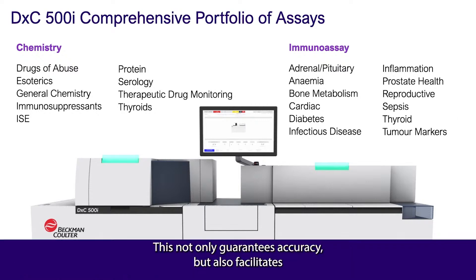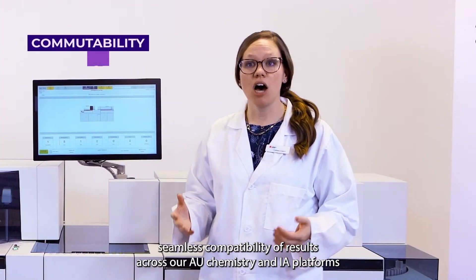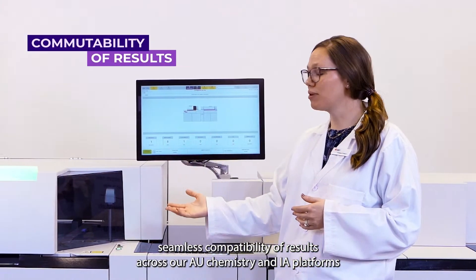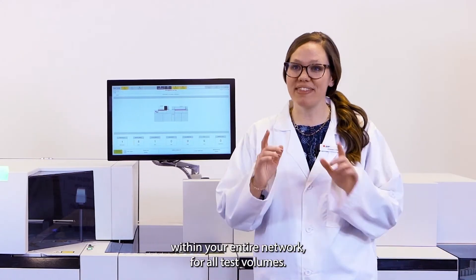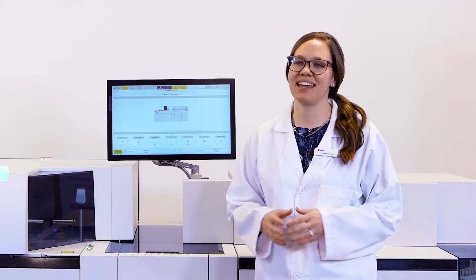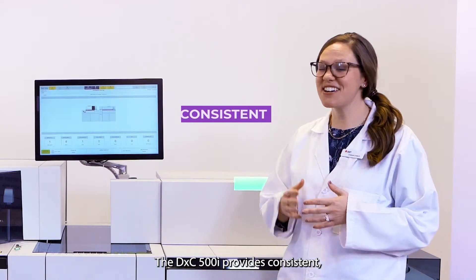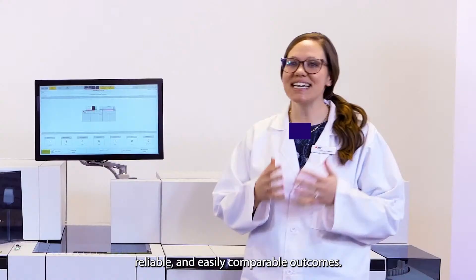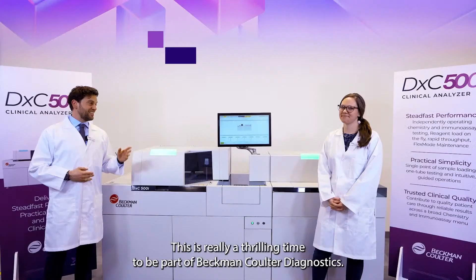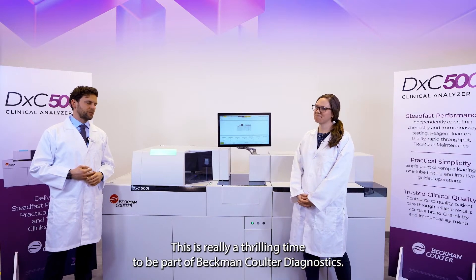This not only guarantees accuracy, but also facilitates seamless commutability of results across our AU chemistry and IA platforms within your entire network for all test volumes. The DXC 500i provides consistent, reliable, and easily comparable outcomes. This is really a thrilling time to be part of Beckman Coulter Diagnostics.